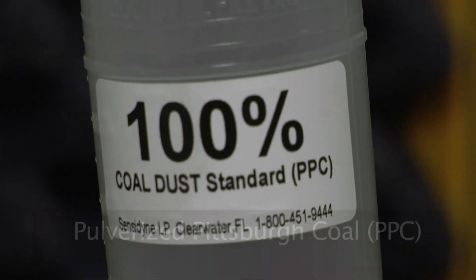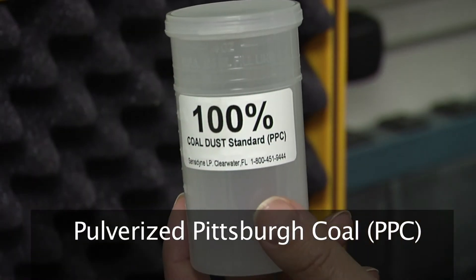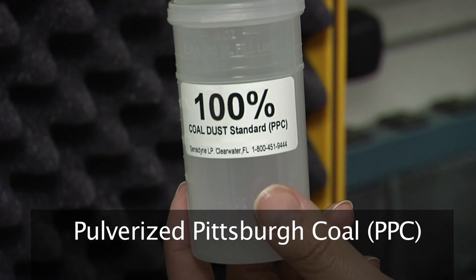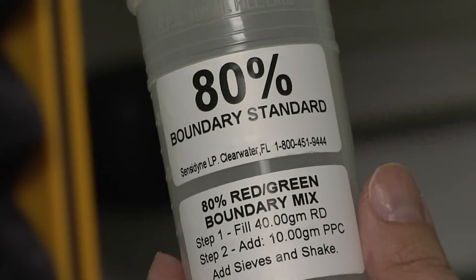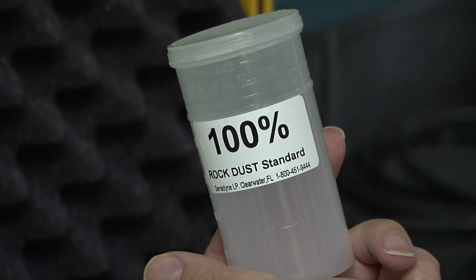Included will also be containers for your calibration samples of 100% PPC, 80% rock dust and coal dust, and 100% rock dust.